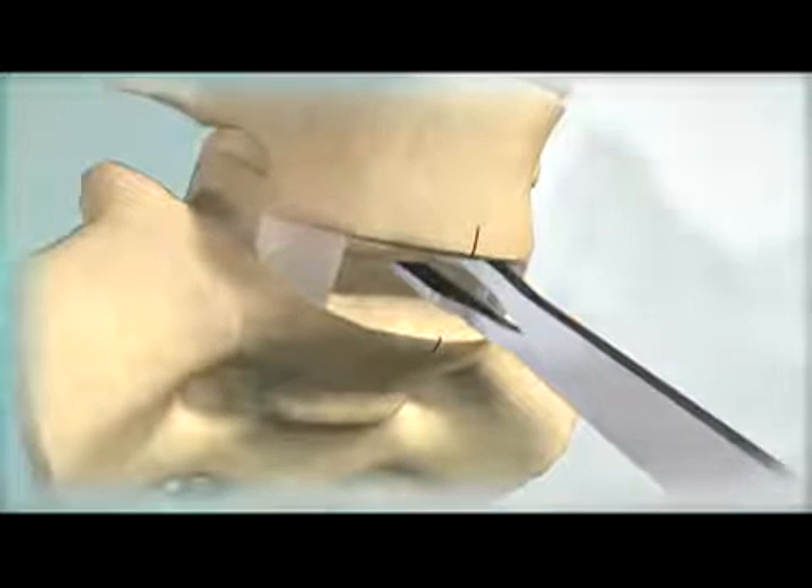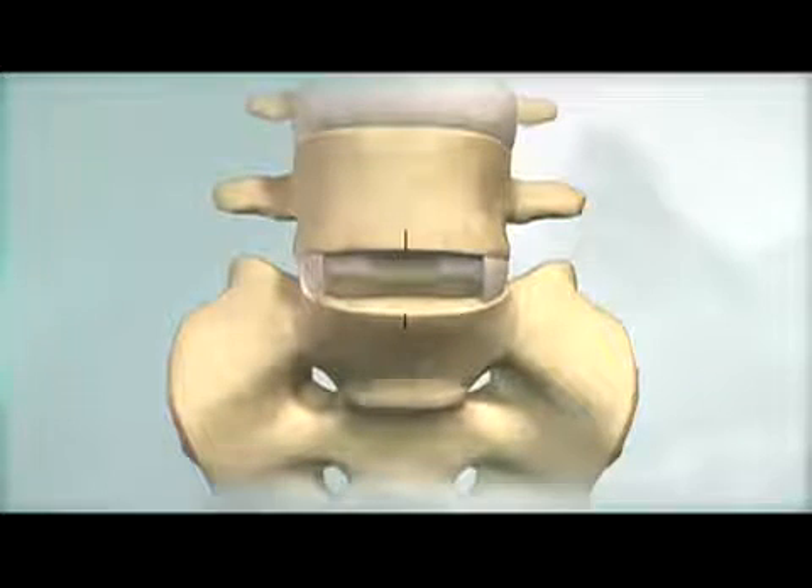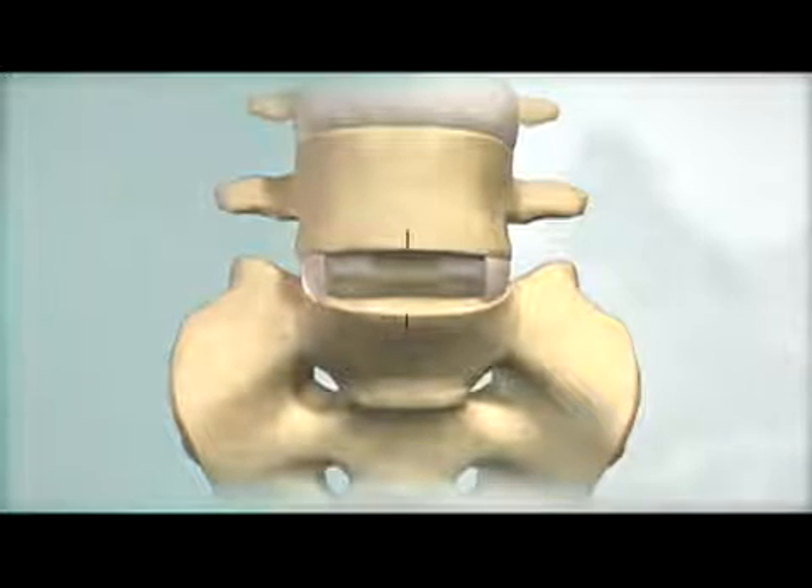Insert the vertebral body spreaders to the posterior margin of the vertebral bodies to gradually remobilize the motion segment. The posterior longitudinal ligament should be completely exposed and released or resected as required to achieve remobilization.